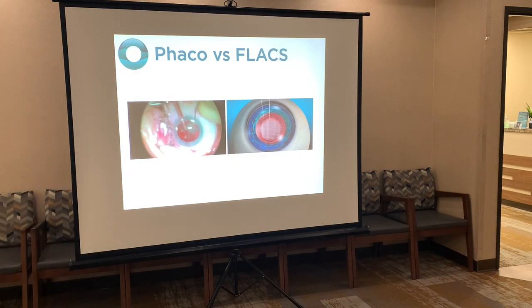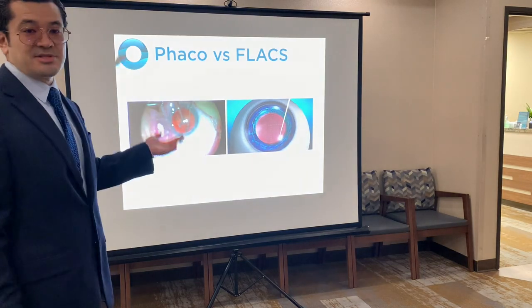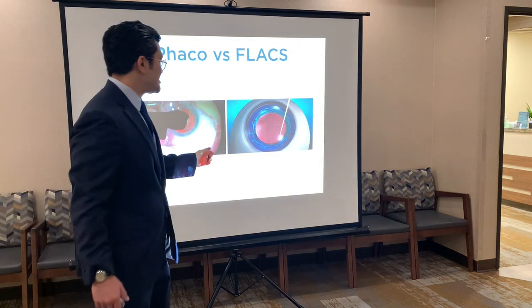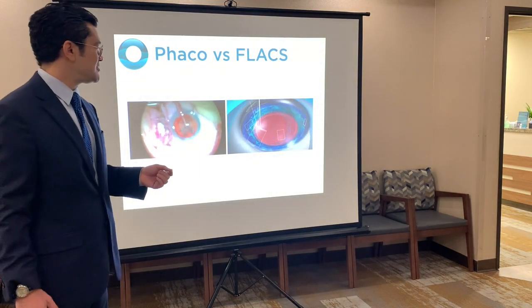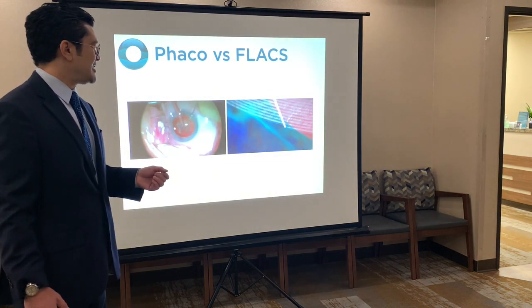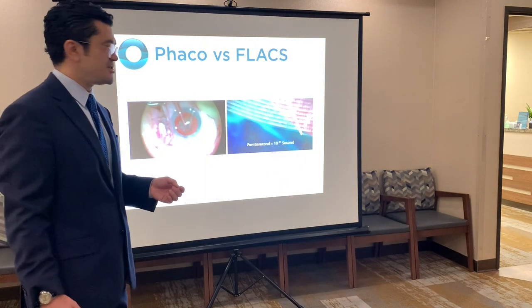Let me reverse one more time so now you can look on the other edge of the screen. So now you're gonna look on the right. Instead of by hand with an ultrasound, we can use the laser. So the laser on this one, you're gonna see it create the capsulotomy. It's perfectly round, perfectly centered. The laser can also create cuts through the cornea for your incisions and tunnels.